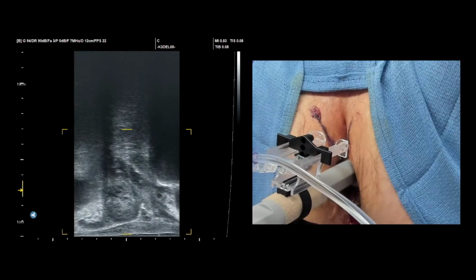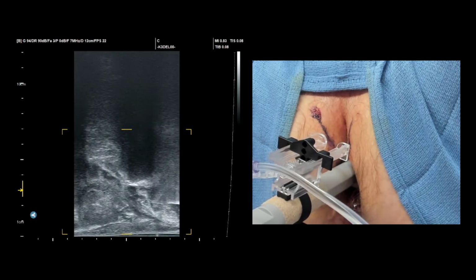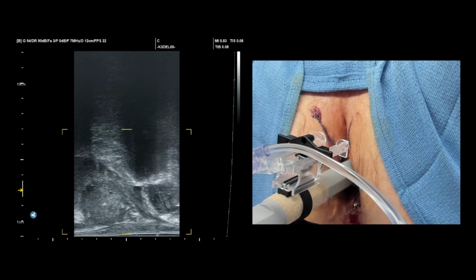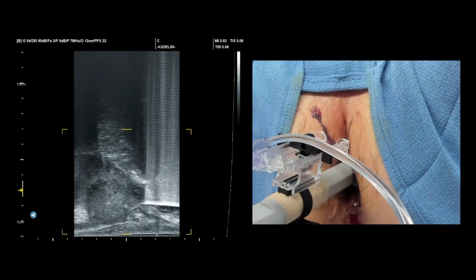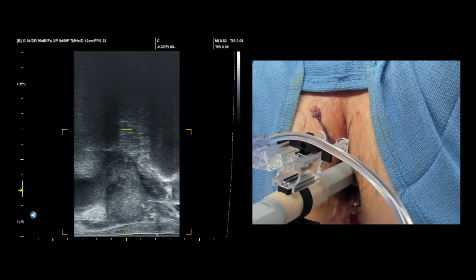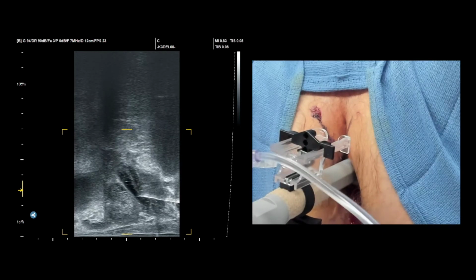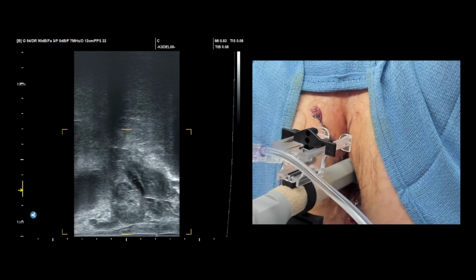A spinal needle is next passed through the access trocar and into the deeper tissue of the perineum under ultrasound guidance. Lidocaine is injected continuously with needle passage along a linear tract extending from the puncture site to the apex of the prostate. Great care is taken to ensure adequate administration of the local anesthetic at the level of the levator ani muscles. Once these muscles have been anesthetized, the spinal needle is used to puncture beneath the endopelvic fascia and a bolus of lidocaine is administered in the potential space at the apex of the gland.